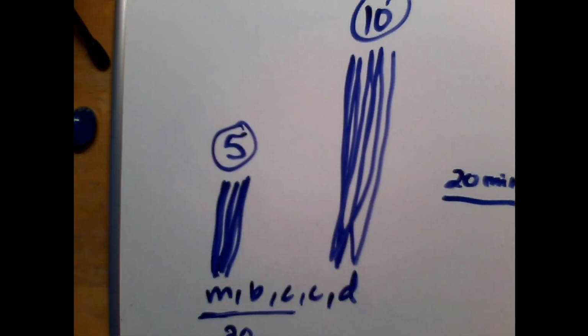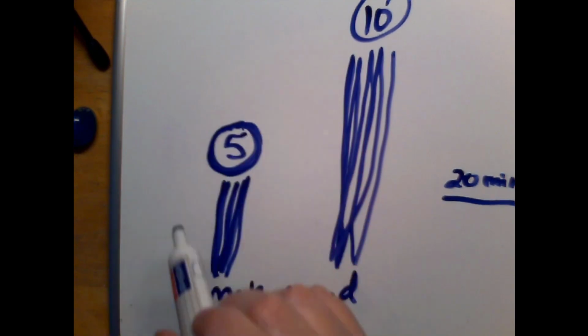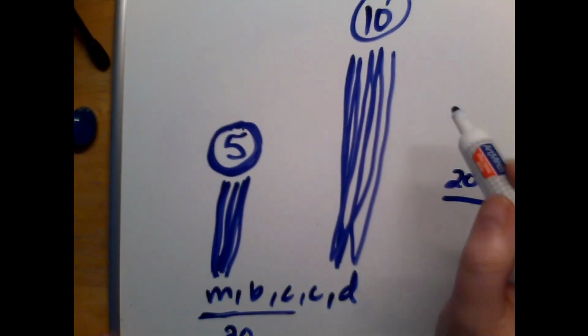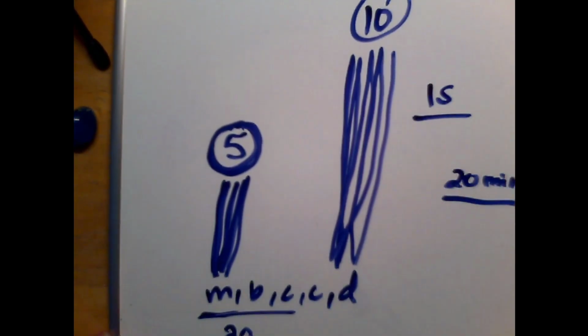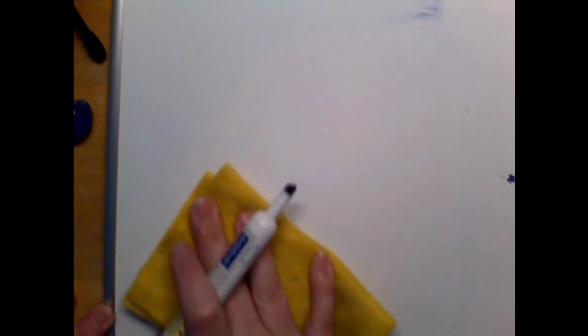So this is just another roundabout way of showing us that when we image shallow, or when we stay close to home, we can get more pulses, or more of our grocery items from our list, within the time frame. Now, our example was 20 minutes, but remember our time frame for ultrasound is 1 second. How many pulses can we send out in 1 second? So that is why it all is related to depth.